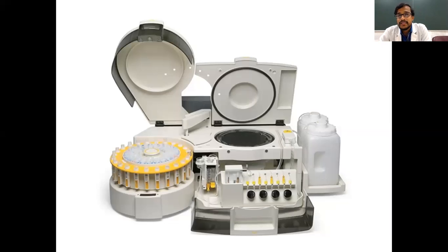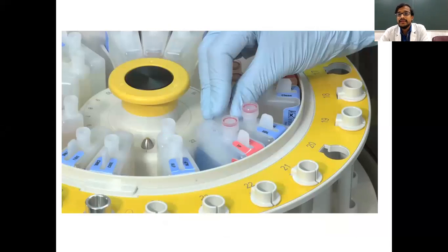So before starting the auto analyzer, we will keep all the reagents and all the samples and all the reaction cuvettes in the analyzer. We have to check in the morning whether all the reagents, all the sample cuvettes and all the reaction cuvettes are present in the analyzer or not. So after all the things are present in the analyzer, the remaining work will be done by the analyzer only. So if you see in detail, you can see here.